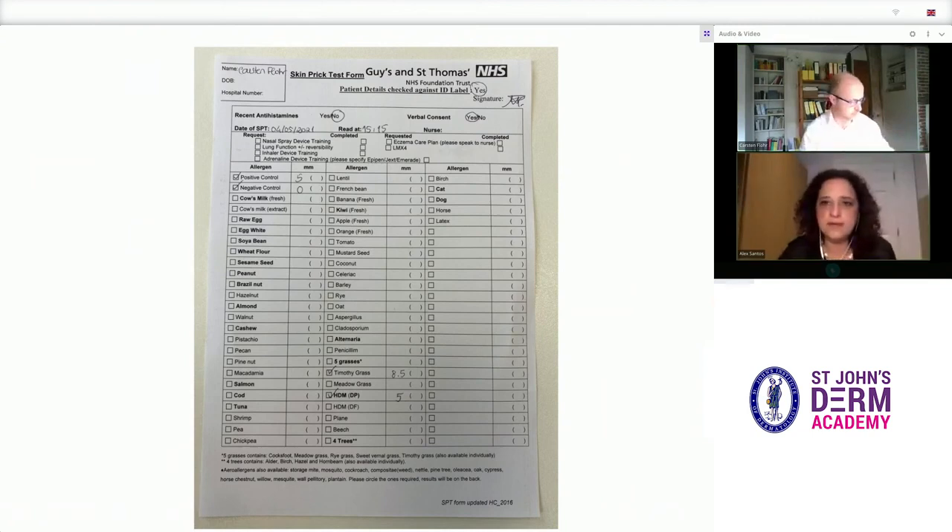This is the pro forma at Guy's and St Thomas' Hospital for documenting skin prick test results. We record that verbal consent was taken, and there is an option to record whether the patient was on any antihistamine. You can see the broad range of food allergens in the left column, as well as positive and negative controls, more food allergens and airborne allergens in the middle column, and further aeroallergens plus blank lines for the patient's own produce and additional allergens to be tested, such as fresh fruits, plants, and vegetables.